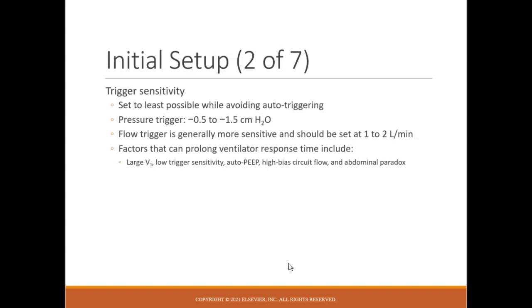If I'm using too much bias flow through the ventilator circuit. I don't know if everybody knows this at this point, but there's constant flow going through your vent circuits. There's never a point where the flow is completely turned off to zero. Most vent circuits and ventilators use what we call a bias flow, which is a continuous flow through the circuit of a minimum of usually 2. So that means that during inspiration I'm giving them 60 liters for their inspiratory flow rate, and then when we go down to exhalation, obviously I'm going to be giving some flow to maintain that PEEP, but that flow also is helpful for always having flow available for the patient for breathing rather than having to suck through the whole entire circuit. And it also helps, especially when you use heated wire circuits. If you didn't have constant flow going through there, you'd be melting all your plastic.